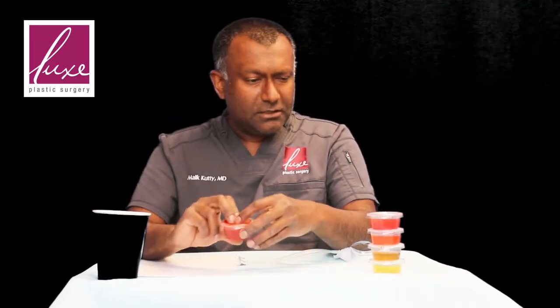I'm going to show you what you can kind of expect to come out. On the very first night, pretty red and kind of thick. Totally normal. You might see some little blood clots and things like that in it. And if you really think about it, it's better to have this out of you than in you. So that's what the drain is for.